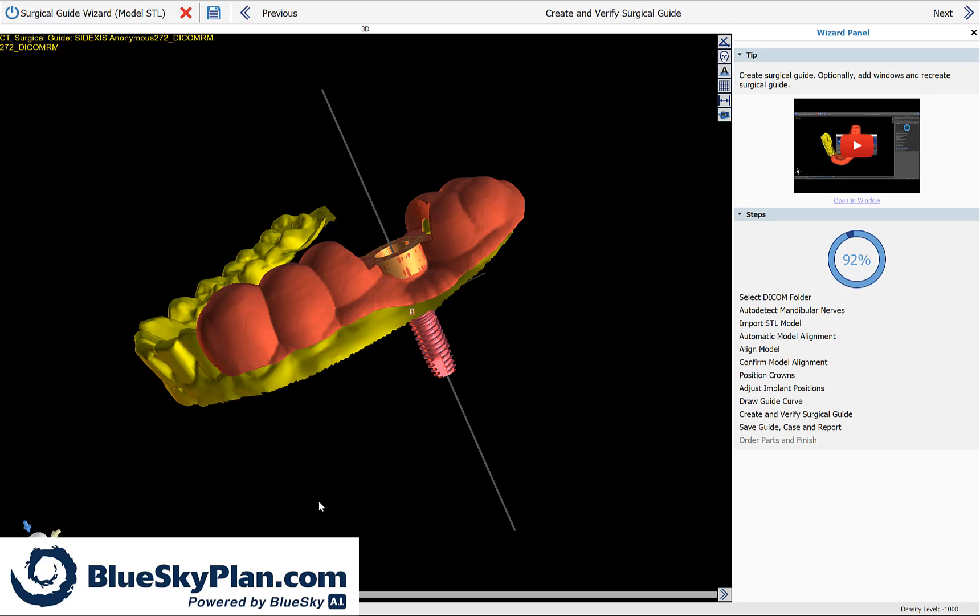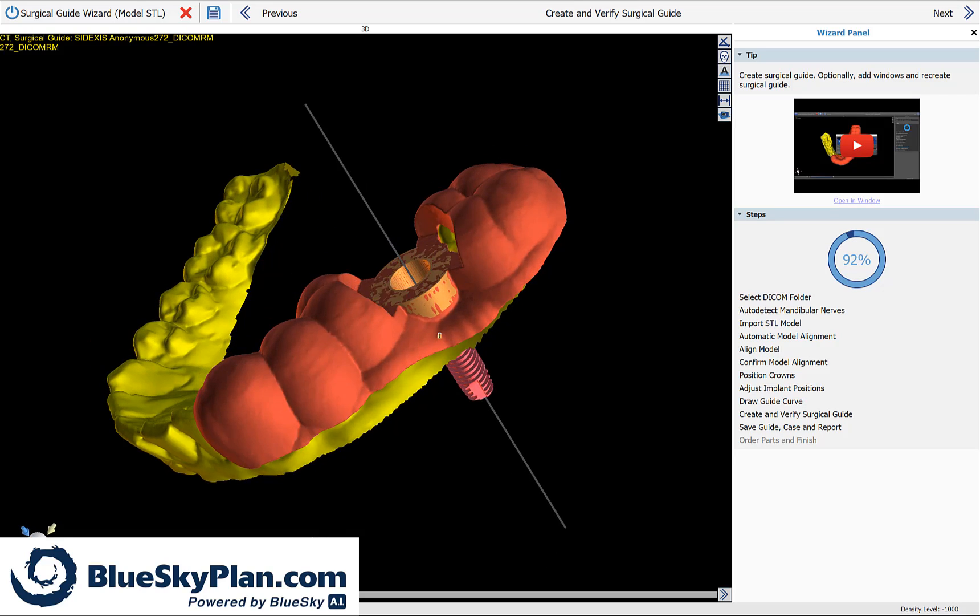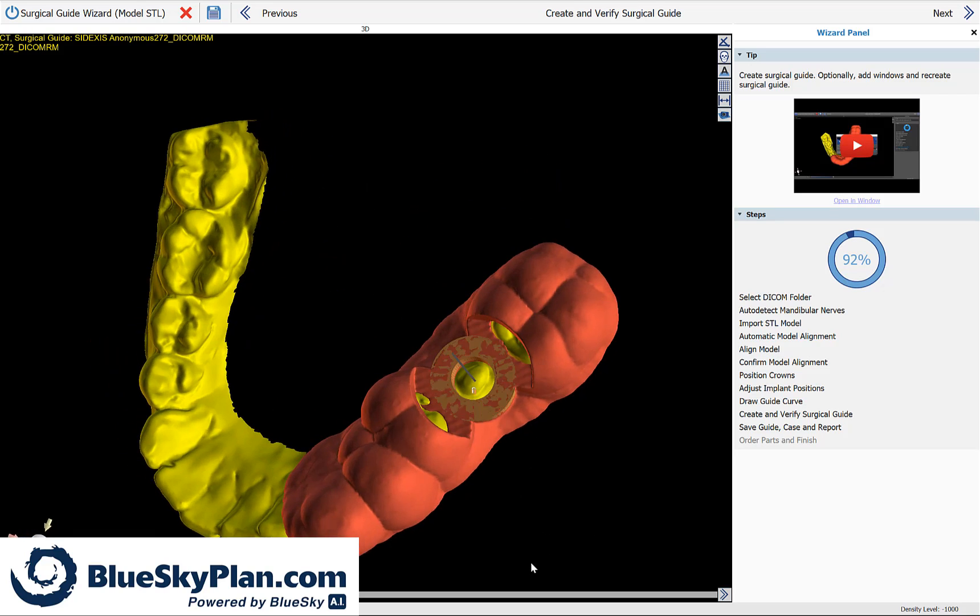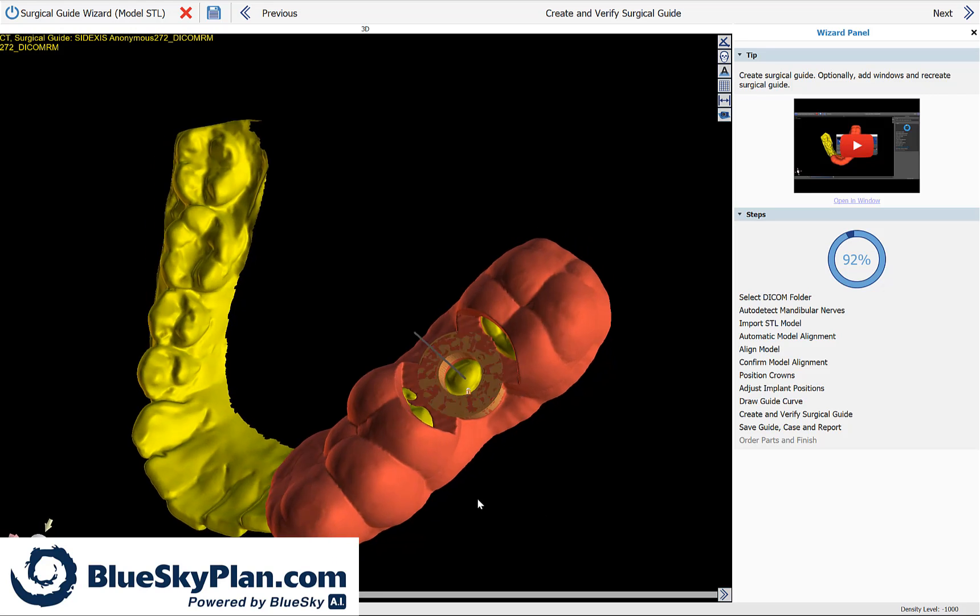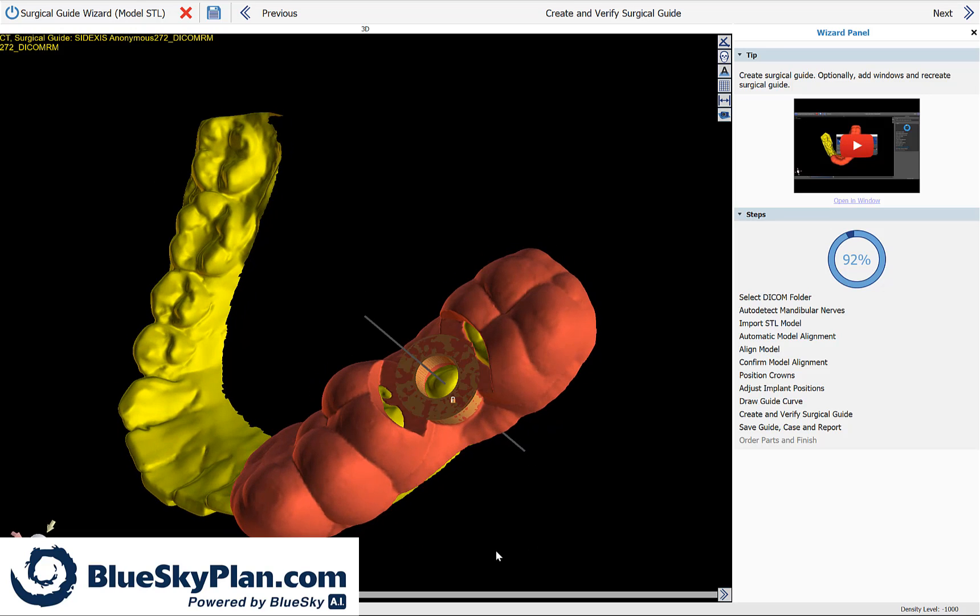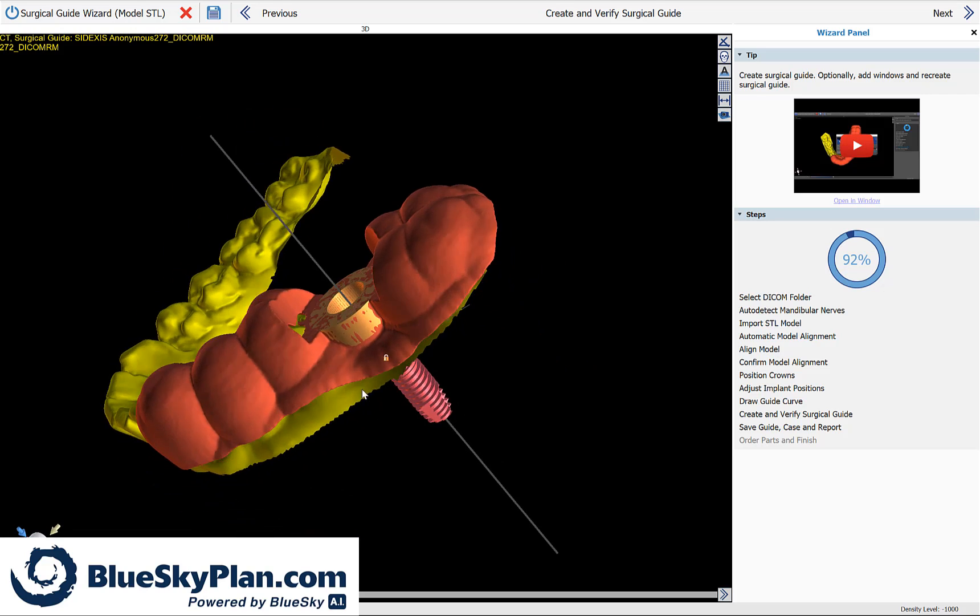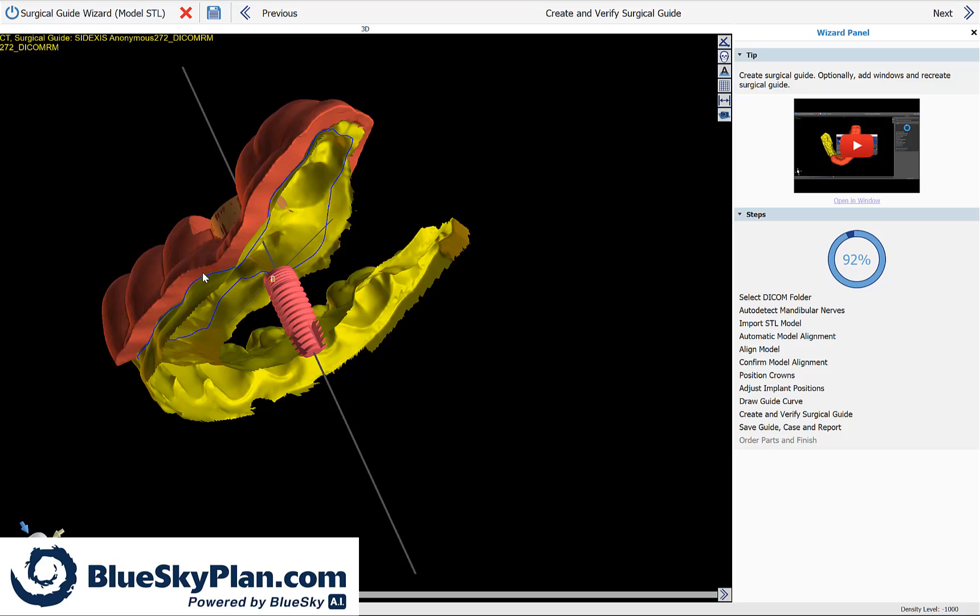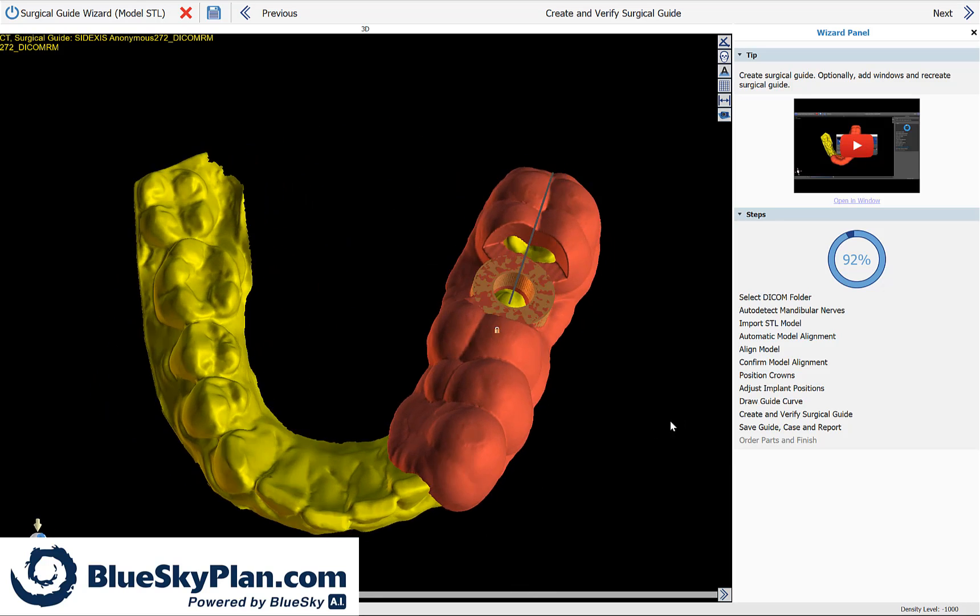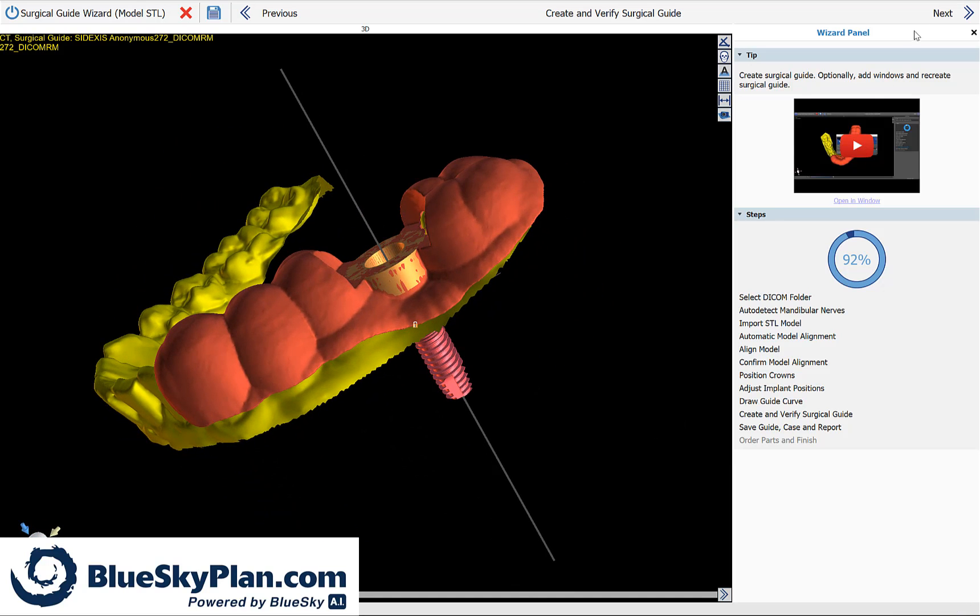And we could see the surgical guide appear on the screen almost magically. We could see how the hole for the surgical guide is positioned exactly in the same position as the brown software guide tube. We could also see that there are windows created automatically adjacent to the osteotomy to improve visibility. Once we've confirmed our surgical guide, we could go ahead and click on next.